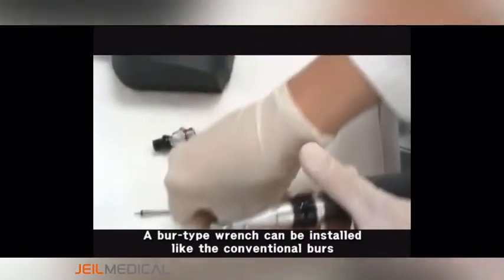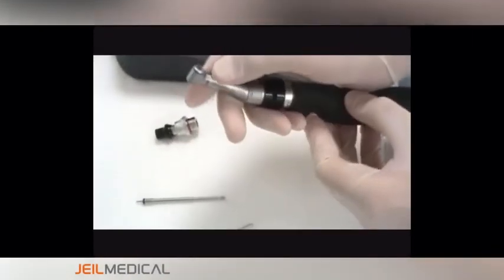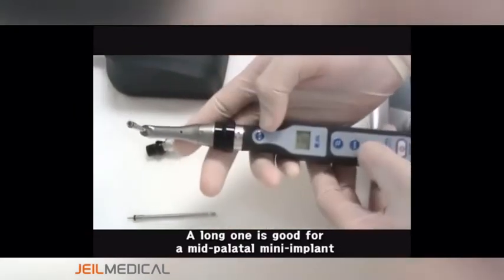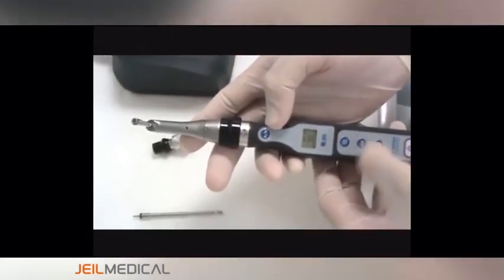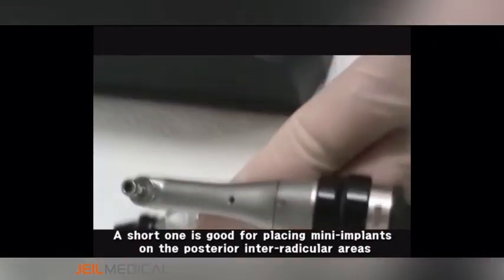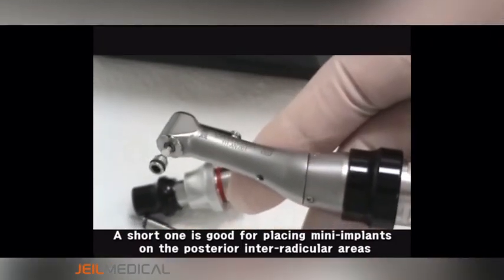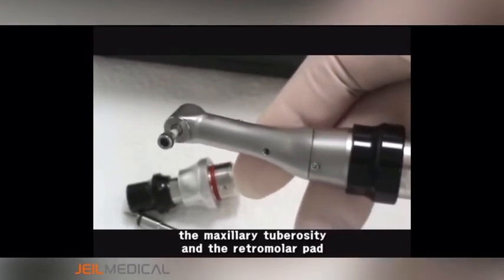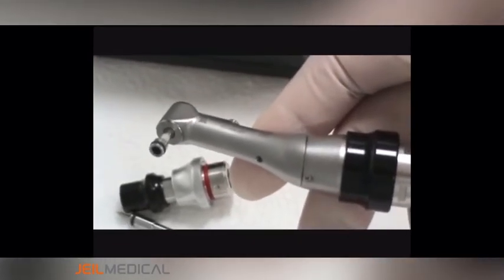A burl-type wrench can be installed like conventional burls. A long one is good for a mid-palatal mini implant. A short one is good for placing mini implants on the posterior interradicular areas, the maxillary tuberosity, and the retromolar pad.